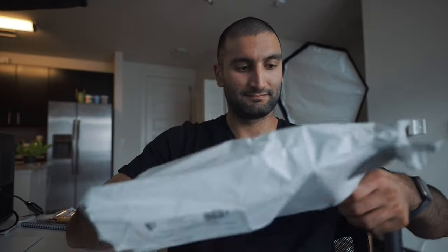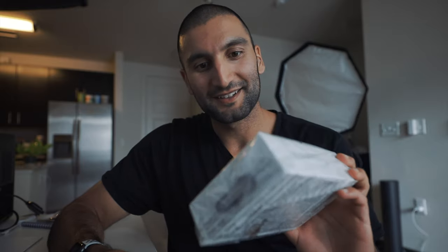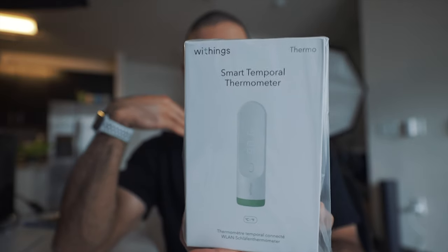Today, we're unboxing it. This is the Withings — so Nokia bought Withings and then essentially separated from Withings. This is the Withings smart temporal thermometer. Obviously, everyone confuses it. Even I just confused it right now. But this is the Withings Thermo.